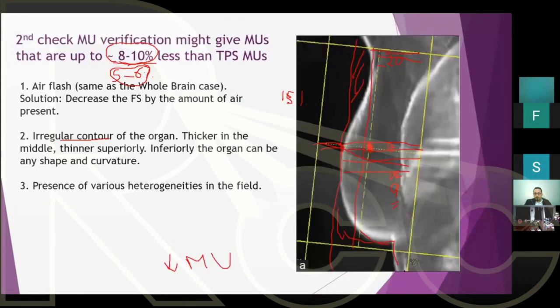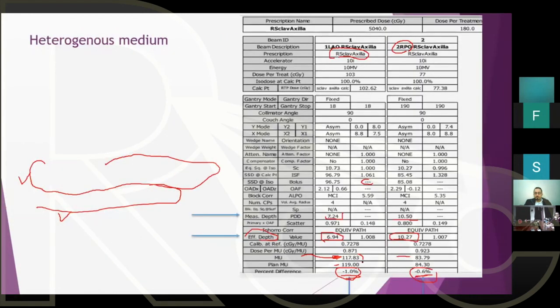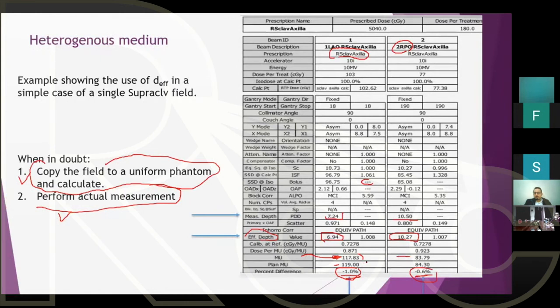Second, checking a plan is an art. It goes beyond looking at numbers. You have to sit down with a good cup of coffee or your favorite beverage and make sure that before you sign off on a plan, you've done a second check.